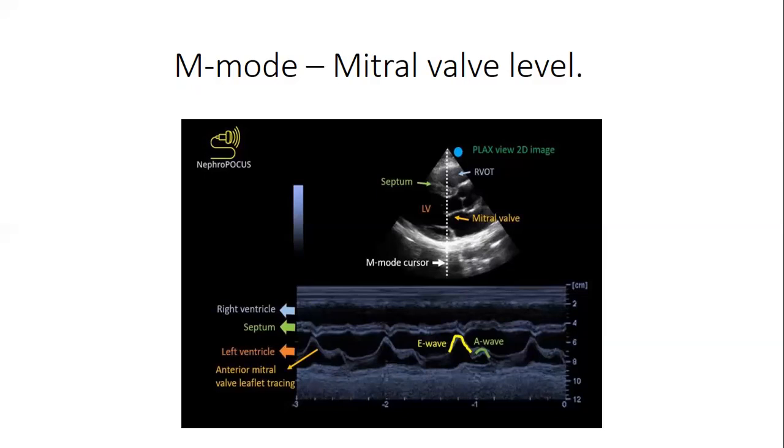Yeah, I just wanted to get it clear to say maybe you might place it somewhere. Maybe let's say we omit the posterior, or maybe by virtue of placing that same scan line obliquely, then maybe we might end up having a wrong wave instead of having the A wave. Maybe it doesn't really come out well, and now you misdiagnose, thinking there's no atrial septal defect. Yes, that's okay. No, I get your point.